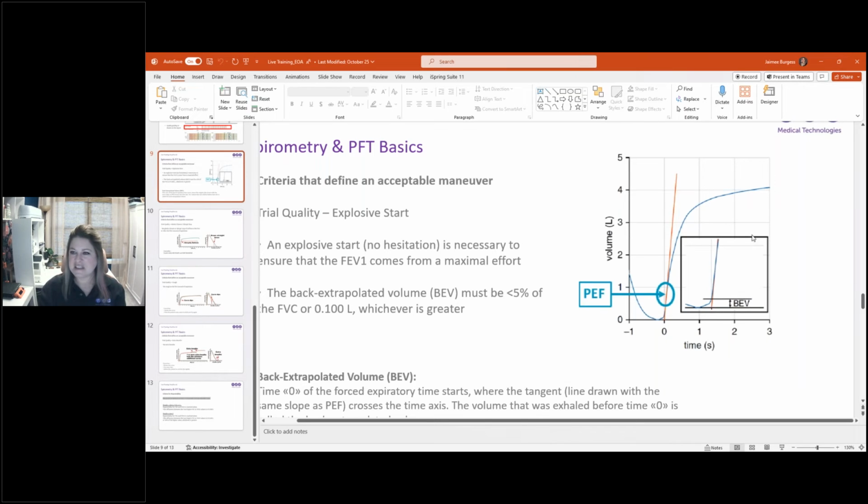Great, thank you. And then another two that are fairly closely related, so I'll read them both. Does the NDD spirometer require calibration? And can you explain how the calibration for this device works?